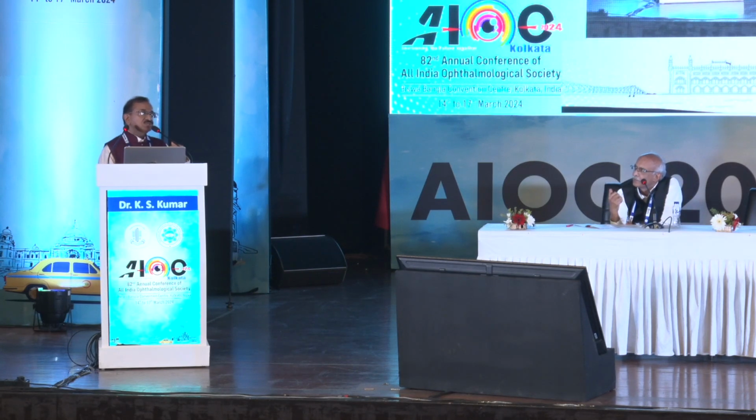And if there is a posterior foreign body which is straddling the coats, half within and half outside, would you rather take a bet on the external approach, disinsert the muscles and go posteriorly, or try the intraocular route? Because dealing with that large posterior wound is a big problem. We had discussion on this. Rajesh has used Abgel to seal the wound there and prevent hypotony.